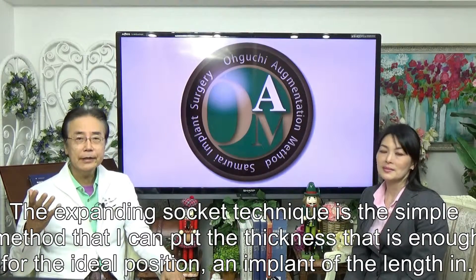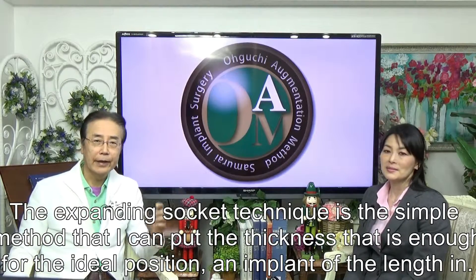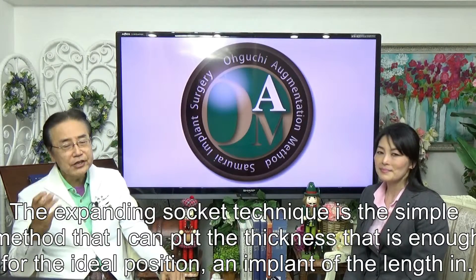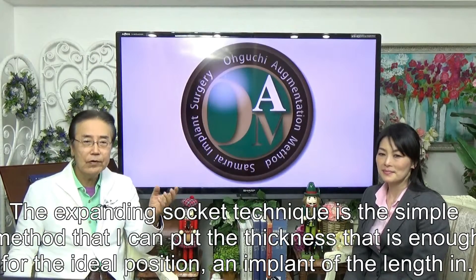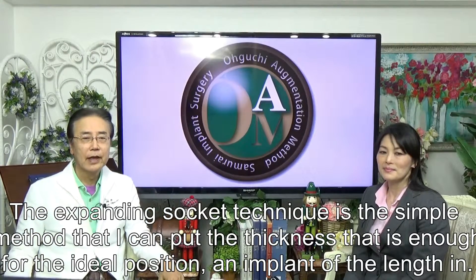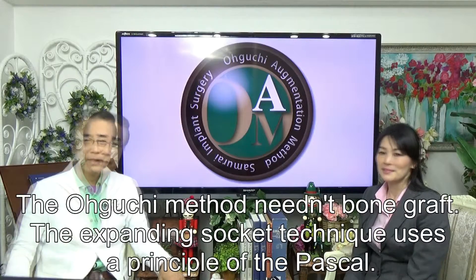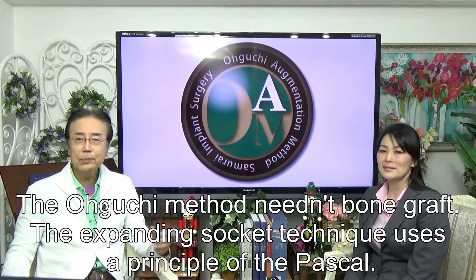The Oguchi Type Expanding Socket Technique is a simple method that allows placement of an implant at the ideal position with sufficient thickness. The Oguchi Method does not need a bone graft.